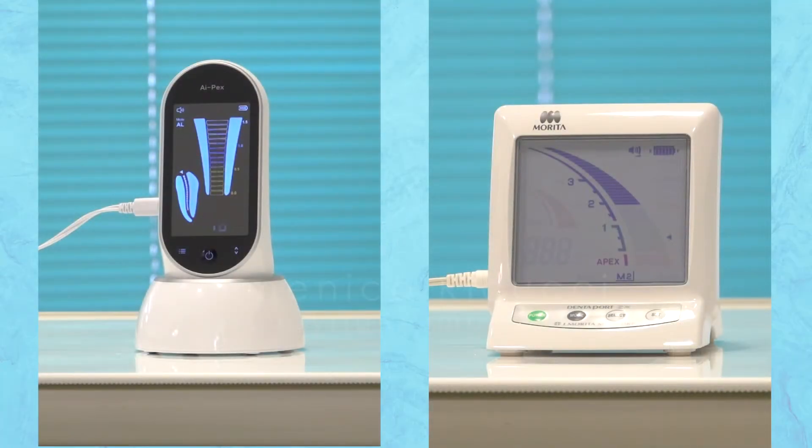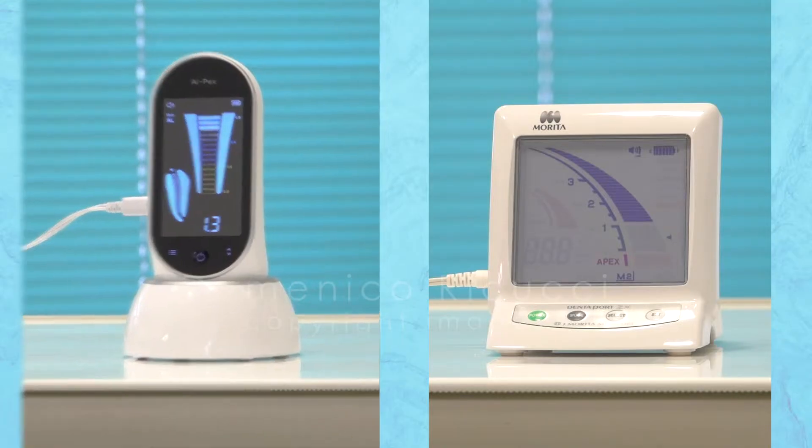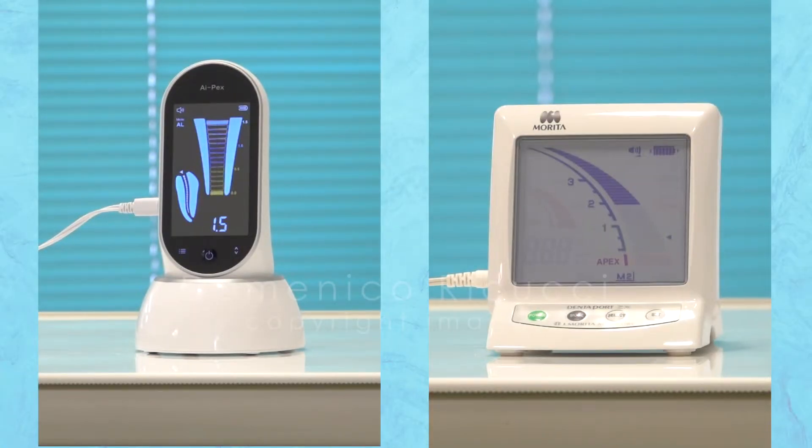In this video, it is my intention to evaluate the clinical performance of the electronic apex locator Apex Woodpecker and to compare it to the Dentaport ZX Morita, taken as a reference device.